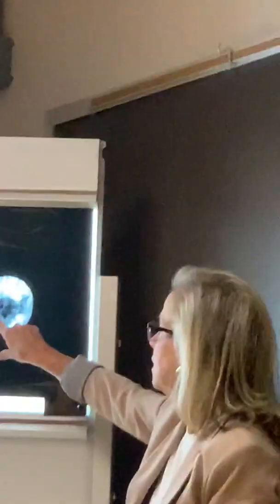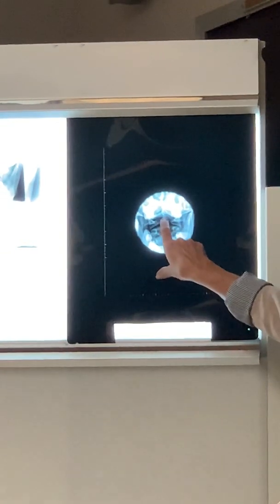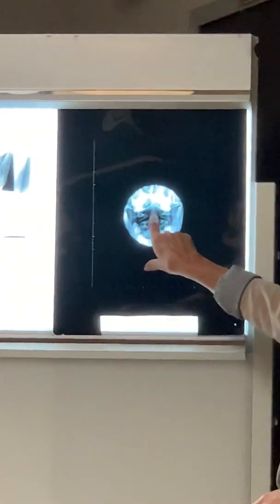We can see the apophyseal joints. You want to see two. You can see the odontoid process. I don't think there's going to be a whole lot. Yeah, maybe they can lift the chin just a teeny little bit. Chad was saying that the teeth are in the way.